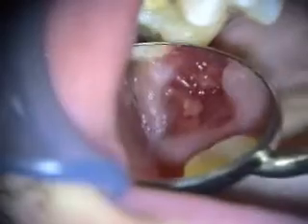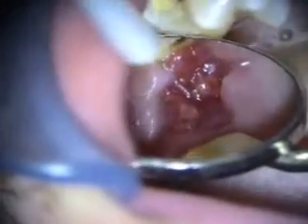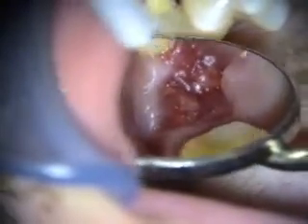This is healing at three weeks. You can see how the tissue is growing over the bone graft. It's a little immature at this point, but it's completely grown over at three weeks. So we're going to take a look at this in a couple months.